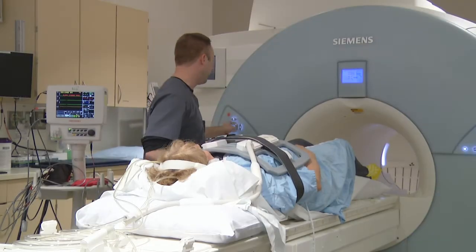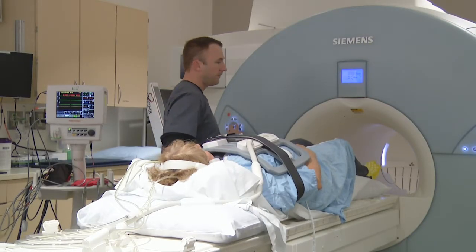Cardiac MRI can really help us figure out why a patient is having abnormal heart rhythm, can help us figure out the reason for a weakened heart, or can help us figure out if their coronary artery disease has progressed.